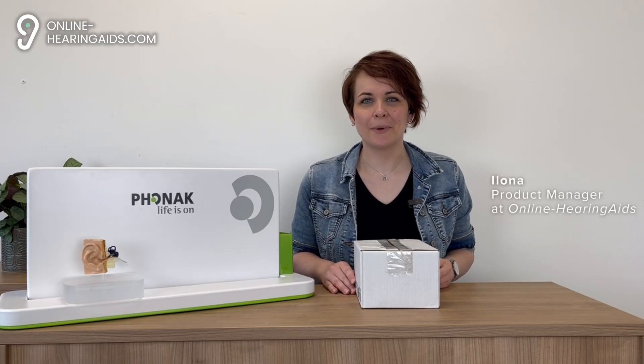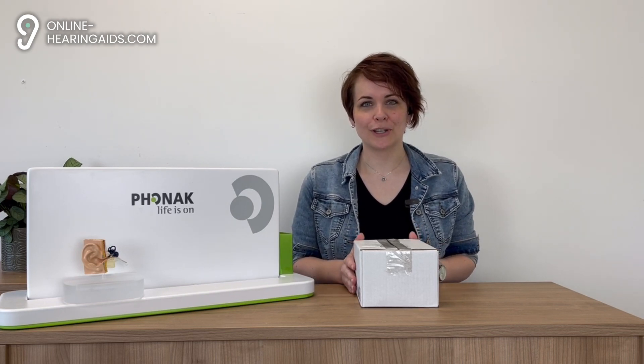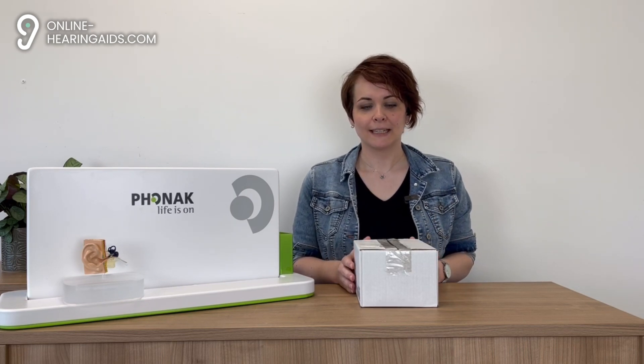Hello and welcome to this unboxing video. My name is Ilona and I am Product Manager at Online Hearing Aids. Today we're going to discover the new Phonak Audeo Infineo series with two of the new models. These models are designed with the latest technologies and offer great features that can significantly improve your life.